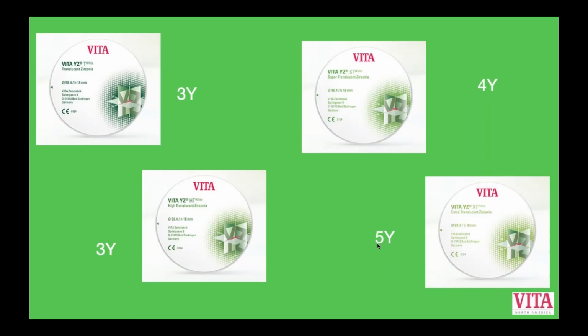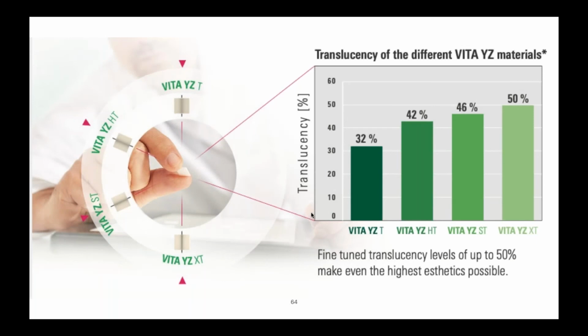And so we have the 3Y, 4Y, and 5Y. You have to be careful you don't get them confused. The translucency of the original YZ was 32%. This is the really strong one, but it can weaken because it absorbs moisture.